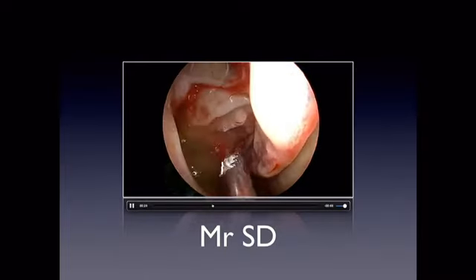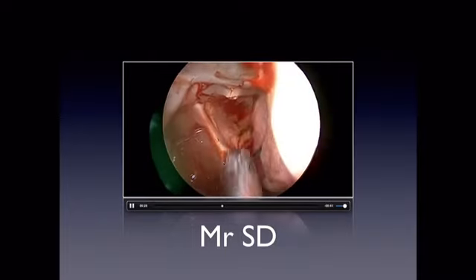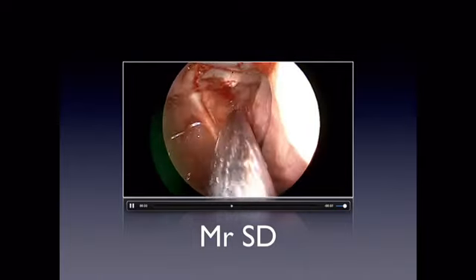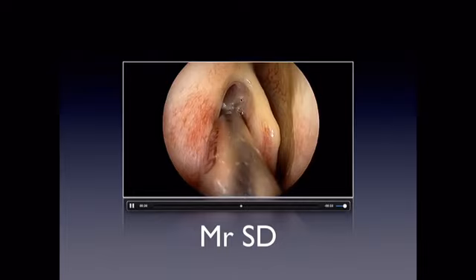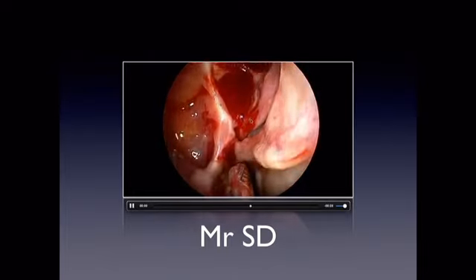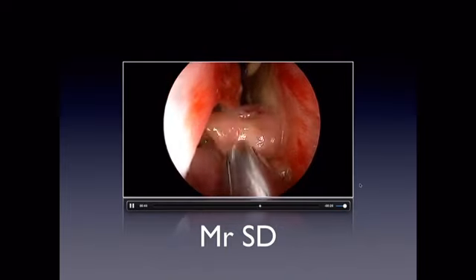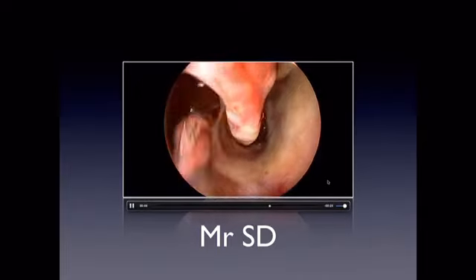And as I get through there, you'll see that there's some previous scarring. It's a really big maxillary sinus ostium. There's a bit of scarring, and that's a bit of a stump of an old ethmoid sinus cell that's been taken down. I'm really just trying to find my way and work out where everything is. So once we've done the transmaxillary, we're through the middle meatus, going underneath into the inferior meatal antrostomy, taking down that polyp, and once again trying to get a view.